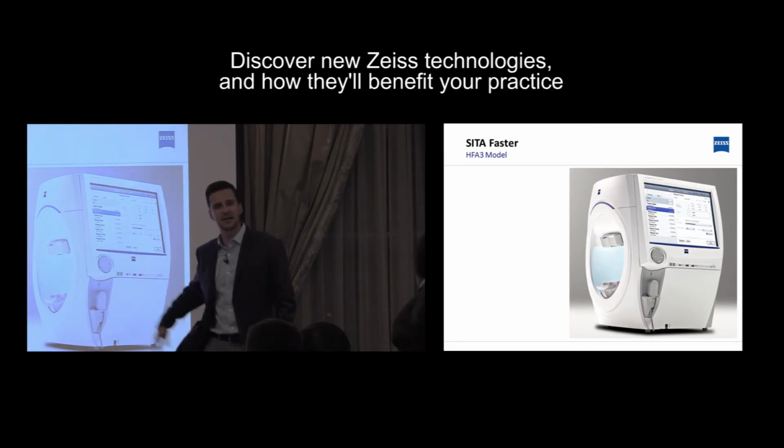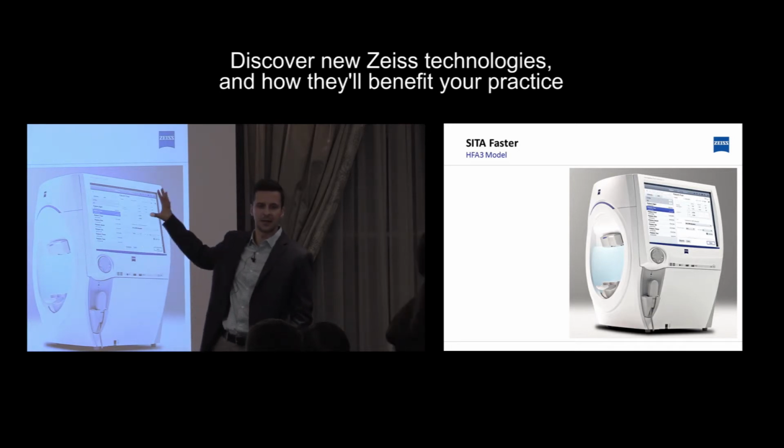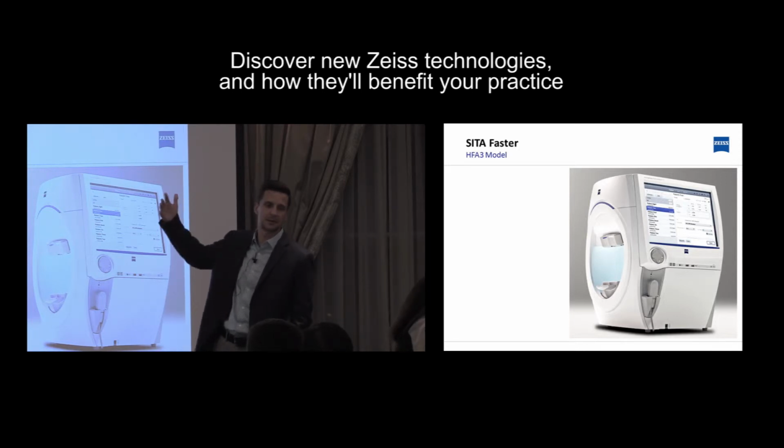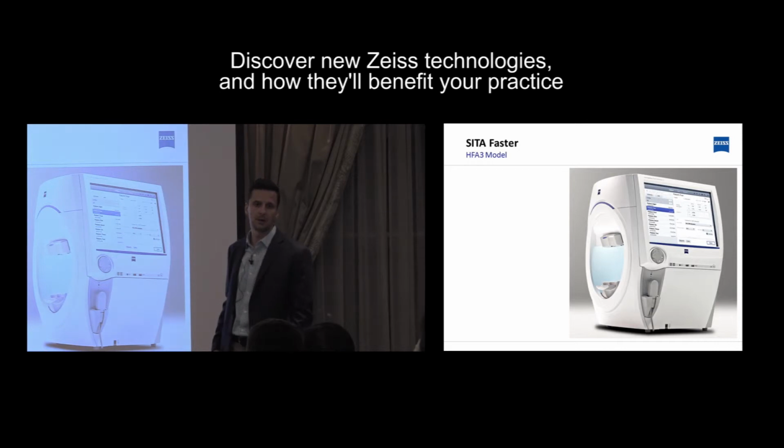I'm not going to suggest that you have this and you document the fundus, and for some odd reason, right at the very edge, you missed a little something that was out there. I'd still say BIO the patient with a history of recent onset of floaters. If they have an established history of floaters, that's going to be a clinical call that you make.